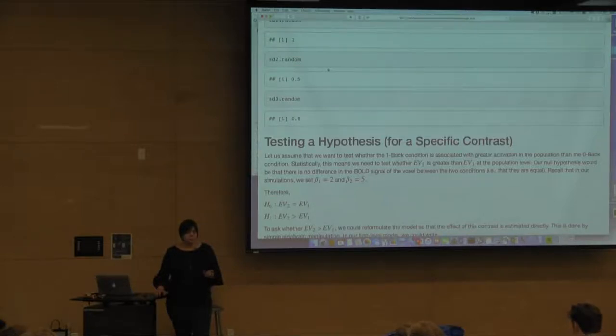So I don't know if people have heard of this talk or whether he maybe gave another version of it last week or something, but he talked about how if we are studying, for example, the effects of emotional salience on, and we show people happy pandas and sad pandas or something like that, we could look at the differences between those, but not all pandas are created equal. And we shouldn't expect that each person is going to have the same fixed response to those different stimuli as well. So here, our EV is calculated as a fixed effect.